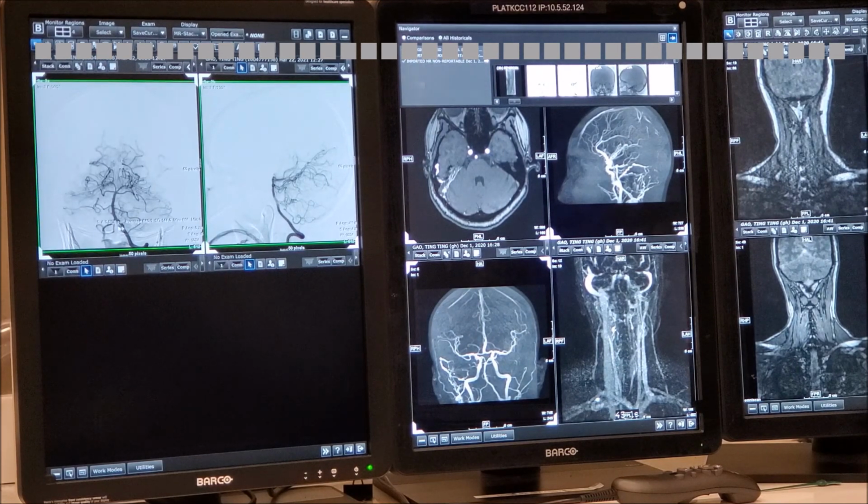The next thing we do, there's reflux here, so there is already a hint of something. But then I go, and this injection is very important to me to see if there is thrombosis or not. The venous system of the posterior fossa is best studied with the vertebral injection, right?